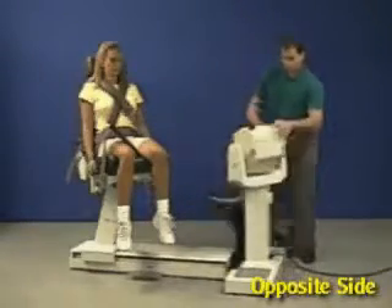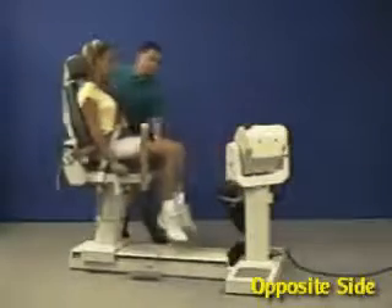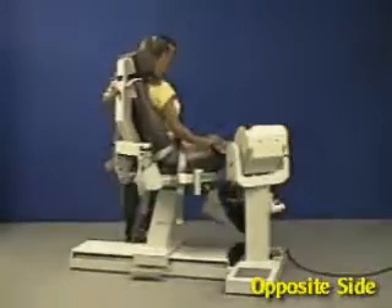Rotate the dynamometer and chair to the opposite 45-degree setting, also labeled knee extension flexion. Move the patient into position, align the axis of rotation, and set new stops for range of motion.